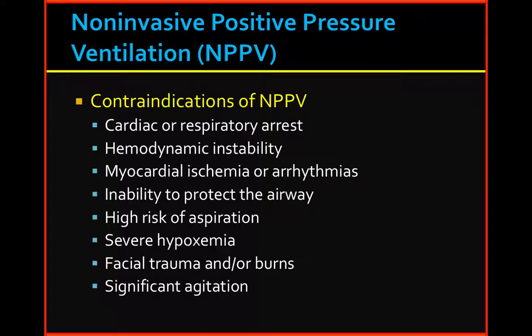of 5. If our patient has no drive to breathe over this setting, or is paralyzed and therefore unable to breathe over the setting, then every 6 seconds the ventilator will deliver our 500 cc tidal volume to our patient. If our patient wants more minute ventilation than this is where you will see the difference between ACVC and SIMV-VC.